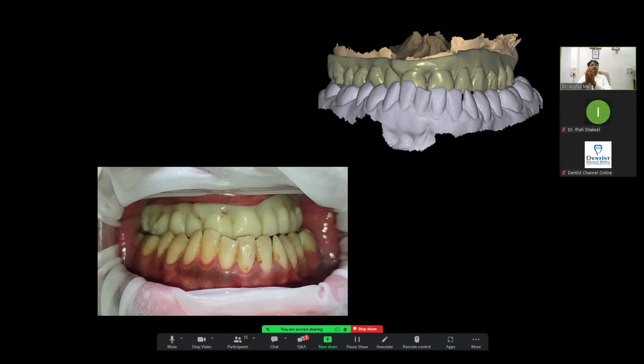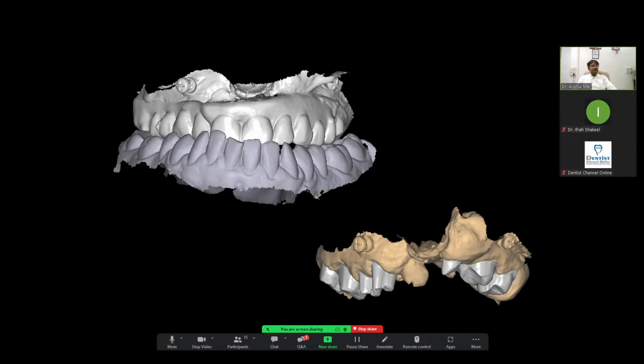Now the doctor wants the same occlusion in the final. As you can see, if the tooth preparation is done on top of this, we lose everything, so we cannot give the same occlusion in the final. So what we have done is place a mini implant like this, the orthodontic implants, onto the area along with the prosthetic. We scan it. So now I have an upper arch with the prosthetic and this pin, then the lower arch in occlusion.